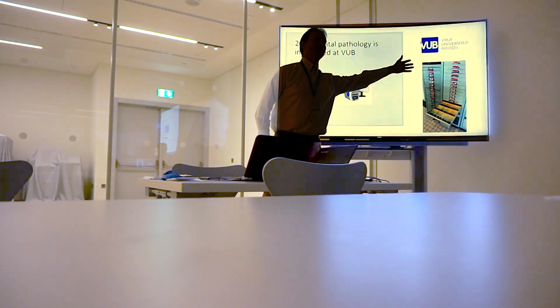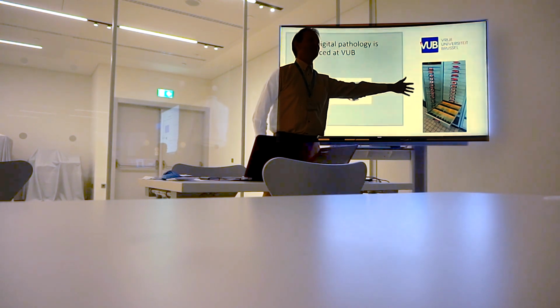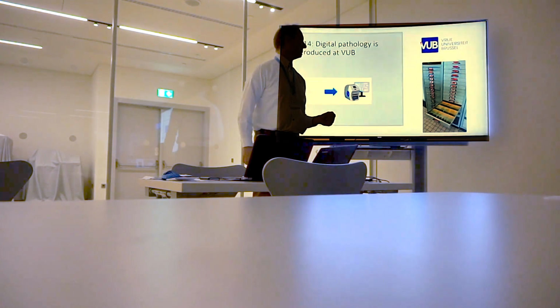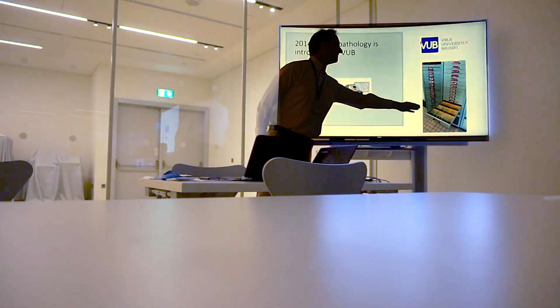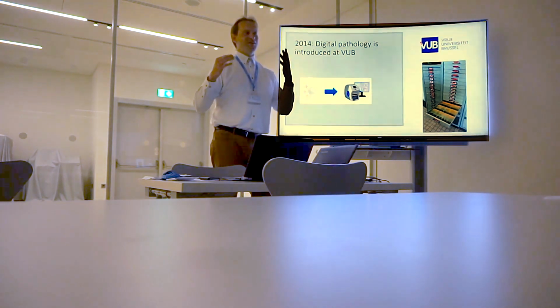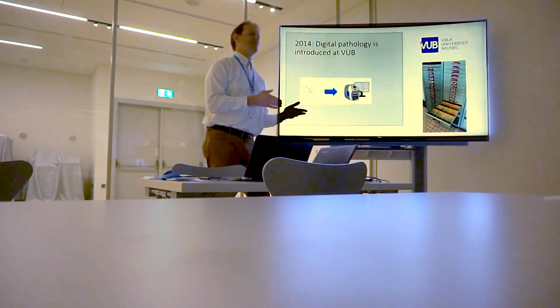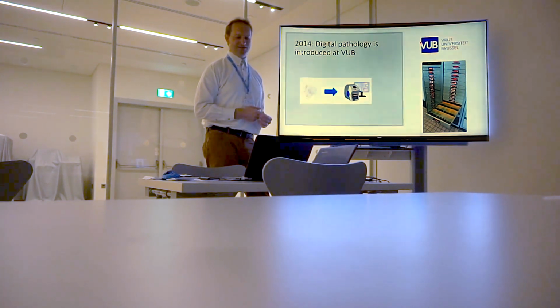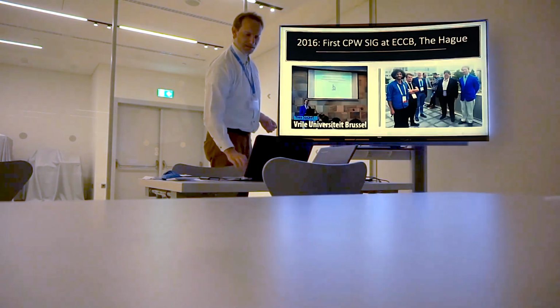You have tons and tons of rooms full of these. Thomas has nice anecdotes about this as well, I know. And then they have a biobank, and of course you want other scientists to consult that biobank, to use that biobank. So they decided to put digital pathology to work there.